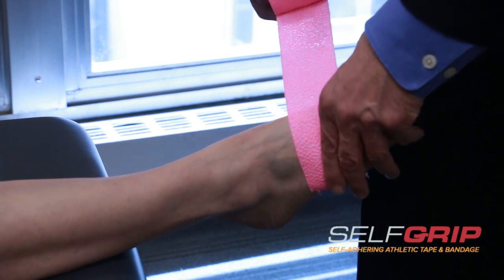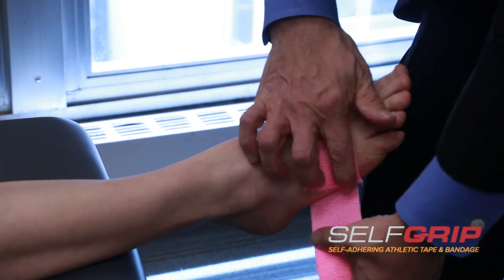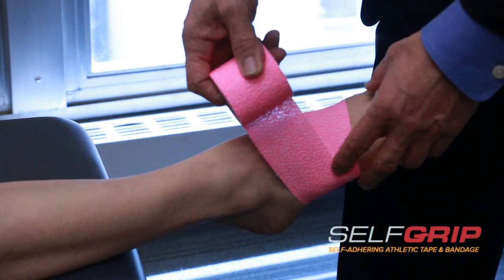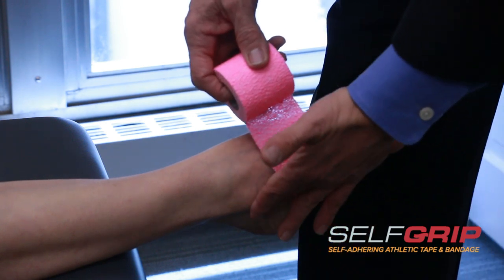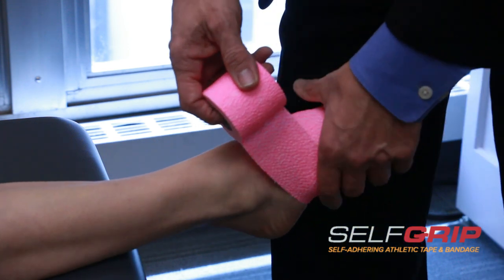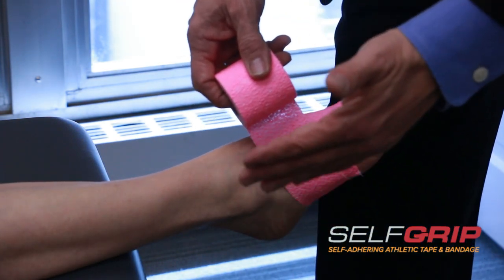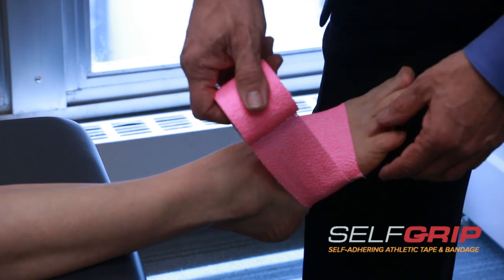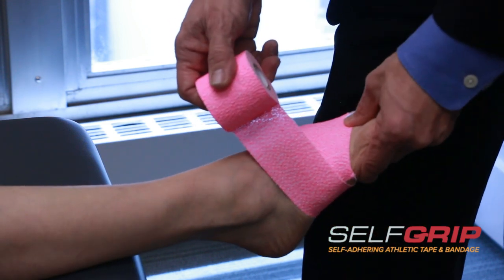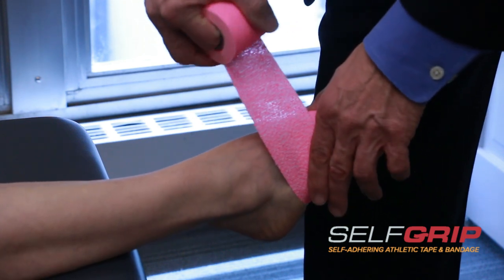We're going to start by running underneath the foot and pulling it up in this direction. The reason we pull it up in this direction is because the large majority of ankle sprains involve rolling the ankle this direction. When you tape, you are trying to limit movement in the injury direction, so we're using tape in this direction — pulling up — which pulls the ankle against that mechanism, thereby helping support the injury.